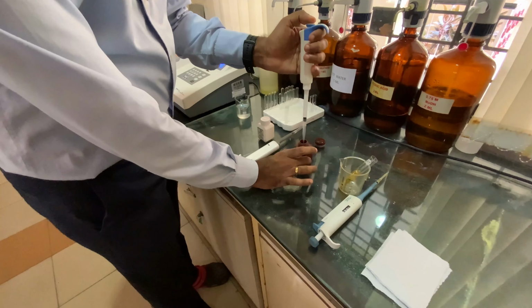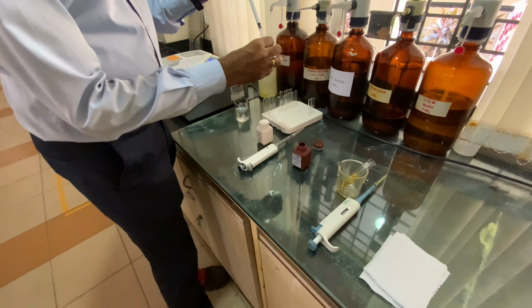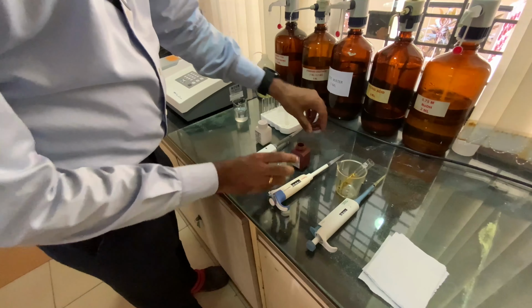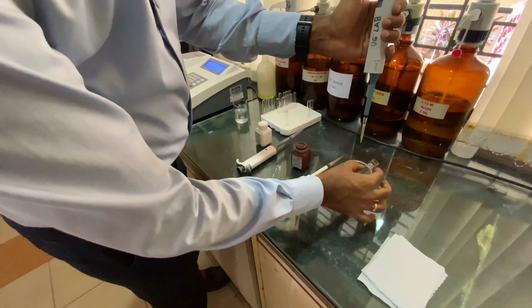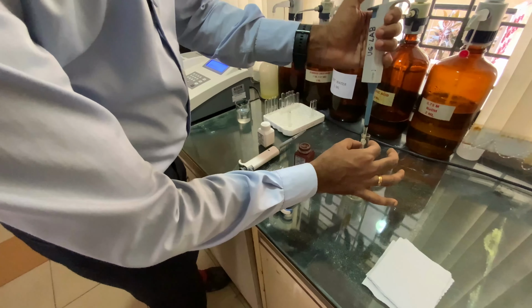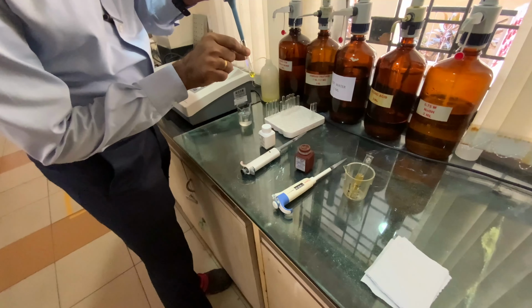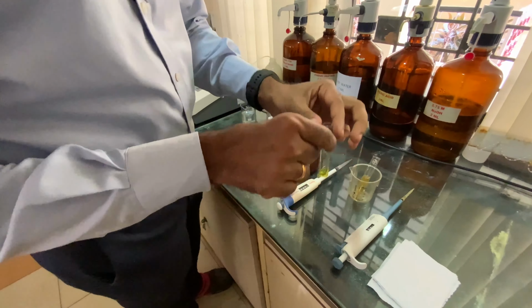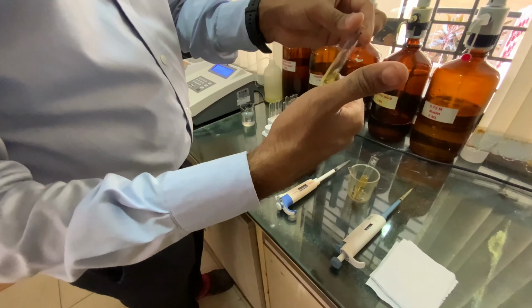Where the volumes that have to be aspirated by the pipette are already preset. The reagent and sample mixture is mixed properly.